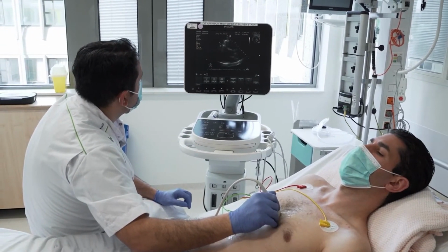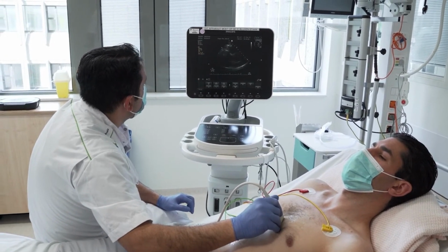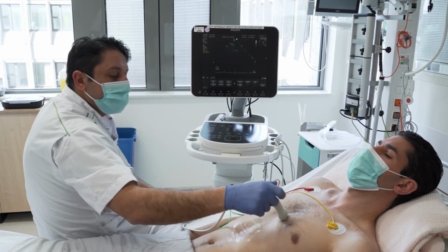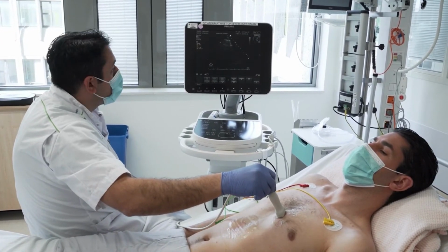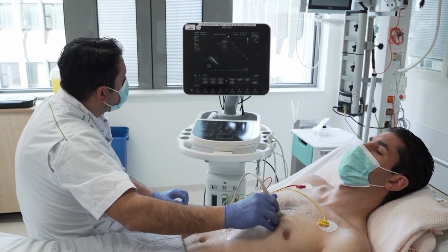The right ventricle is very empty. It says something about your filling status. From the parasternal long axis, we can turn 90 degrees and we get axial views of the heart.